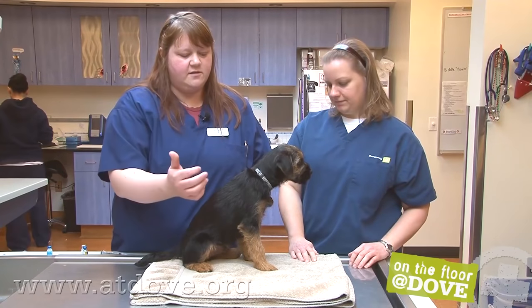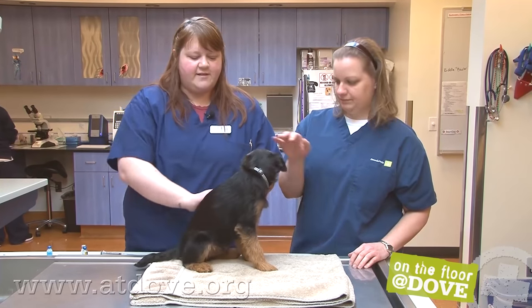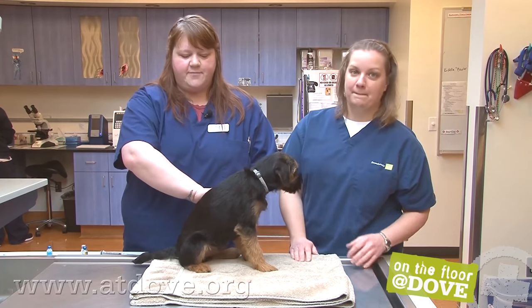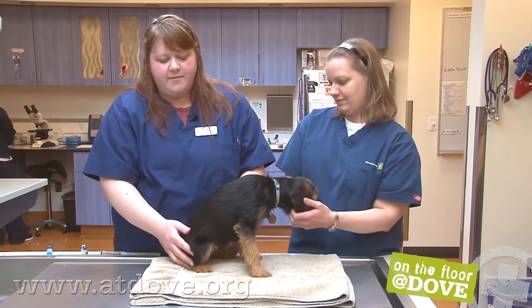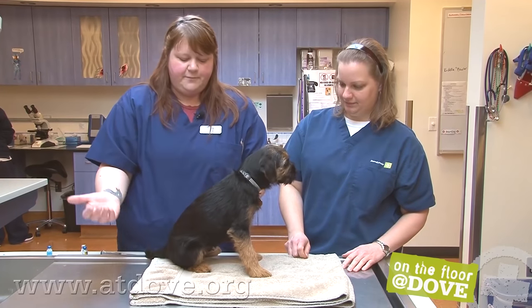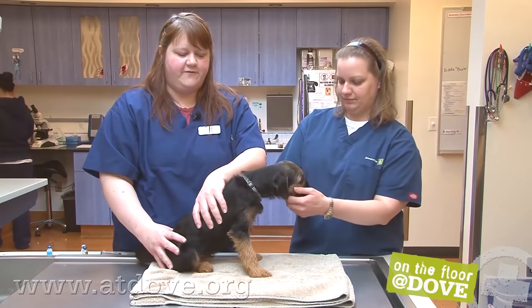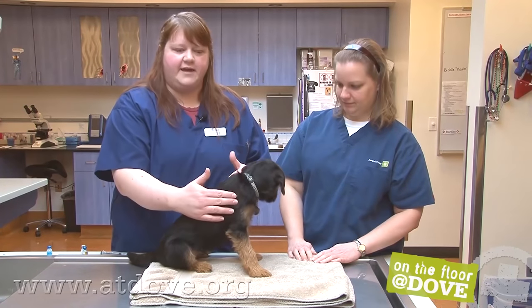So four vaccines: the distemper vaccine is going to go in the right shoulder, the Bordetella vaccine goes in the left shoulder on the opposite side. If we were vaccinating for rabies it would be the right rear, and lepto goes in the left rear. Four different spots for four different vaccines, so we're not putting them all together.